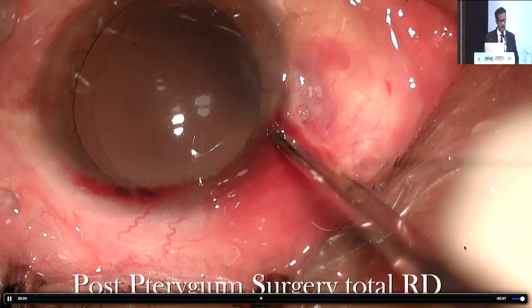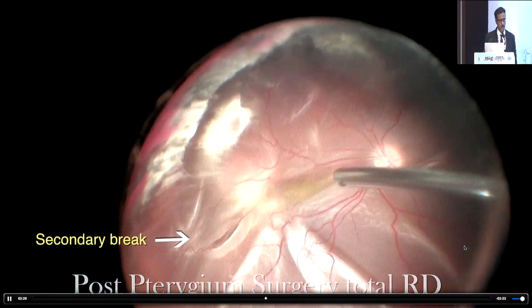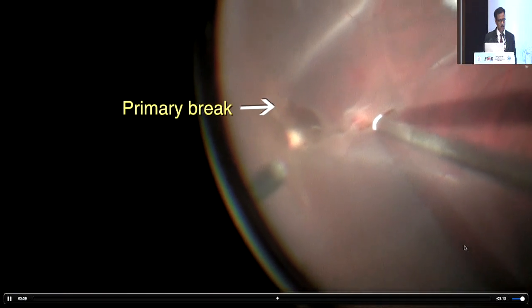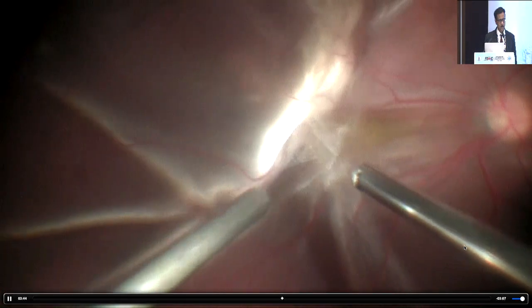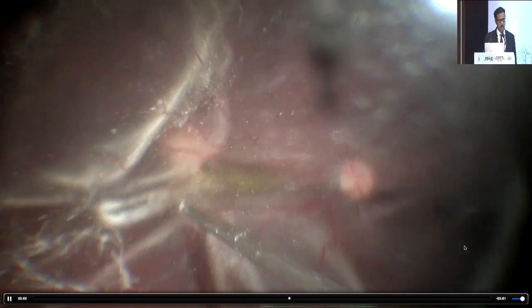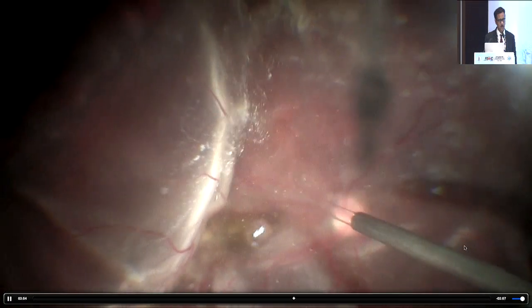In a surgery for pterygium excision, macular secondary breaks happened with vitreous hemorrhage and retinal detachment. A primary supratemporal slit-like break indicated the wrong site of the superior block. Triamcinolone-assisted PVD induction done. PFCL injected.